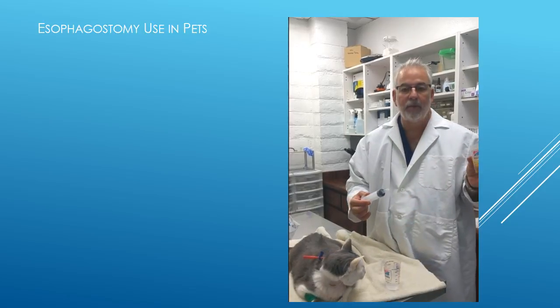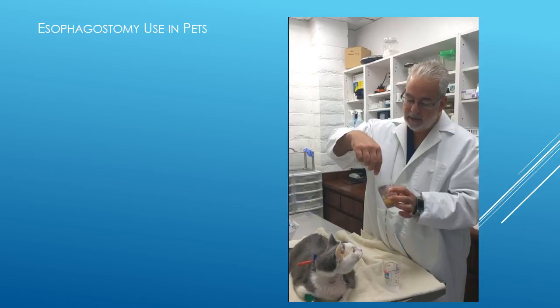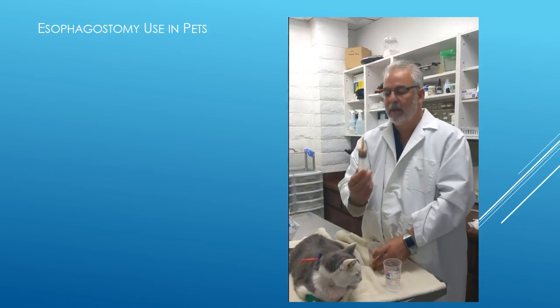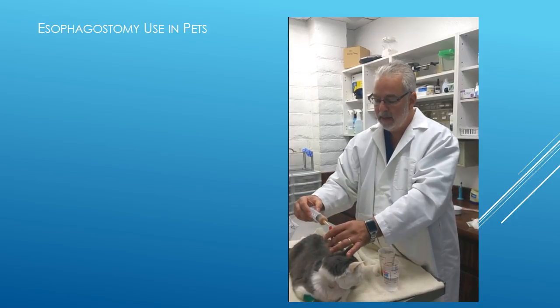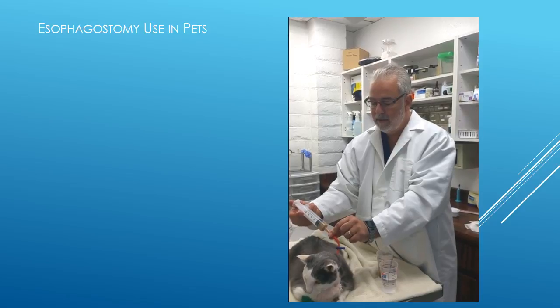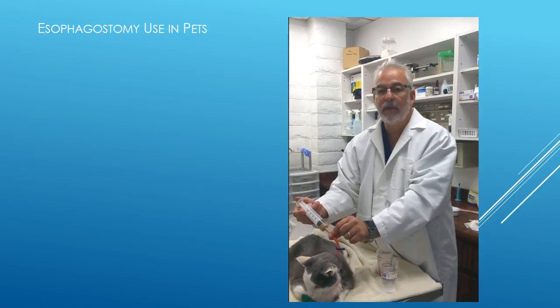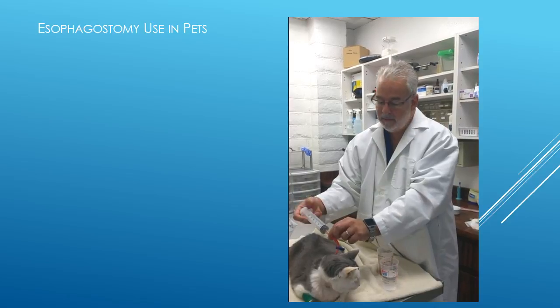Now we've got our food that we already diluted. I'm going to suck up, let's say in this case, another 15 mLs of the food-water solution. I'm going to introduce that into the tube, holding it tight at the end so it doesn't squirt out, and just very slowly introduce that food into the kitty. You can see how easy this is — the cat doesn't seem to mind.